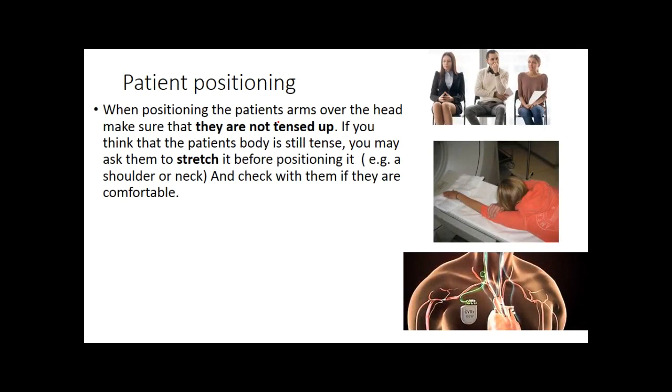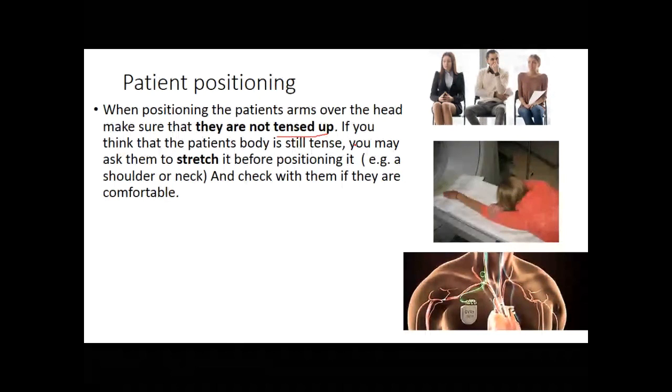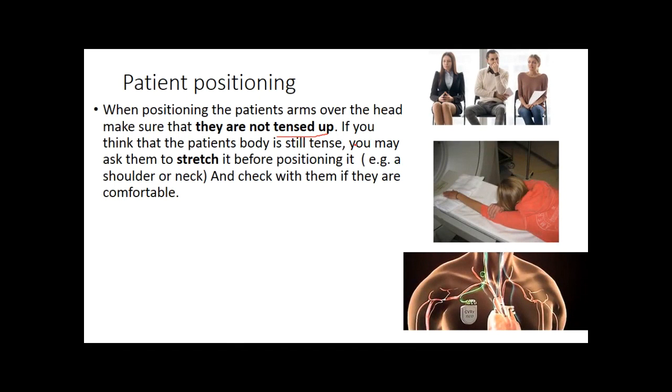When you try to position the patient, one thing to keep in consideration is that the patient has been sitting outside, they are stressed, they are tense, their muscles are tense, and if you put them in position and they are still tense, they might reposition themselves during that exam, which will cause a change in position or a motion artifact. So a good thing to do is to ask them to stretch before the position.